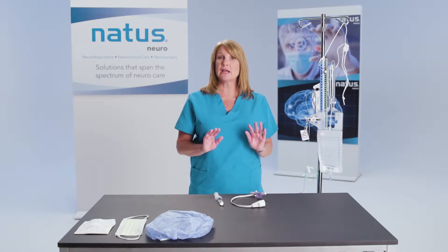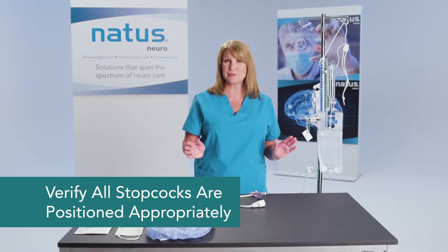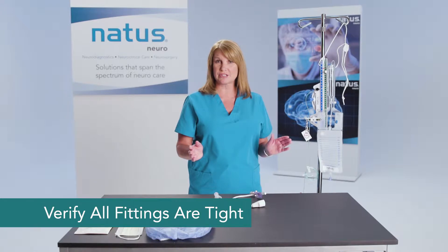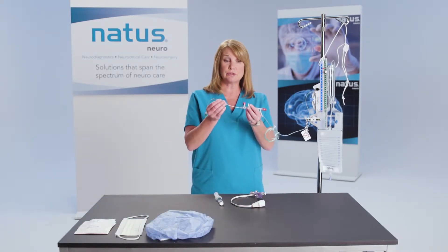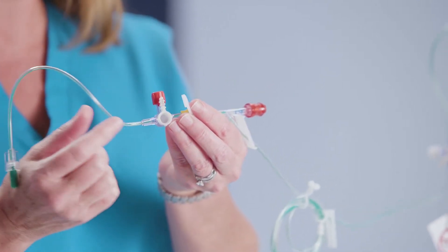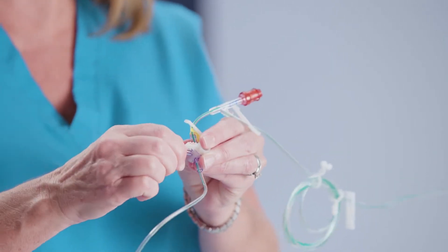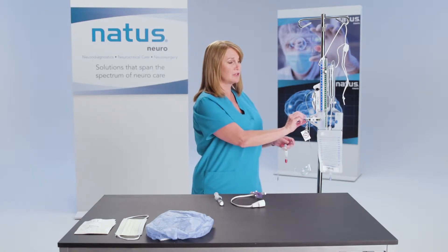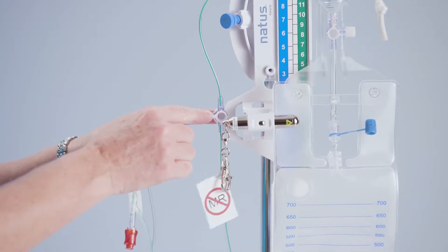Before we add the transducer, I want to make sure that all my stopcocks are positioned appropriately and that all of my fittings are tightened. I'm going to start at the end of the tubing and make sure that my stopcock is positioned in a way that allows for priming, and I also want to make sure that my cap is on tight. Same for my system stopcock — make sure my fitting is on and that my stopcock is positioned appropriately.